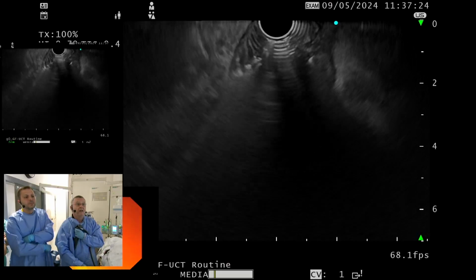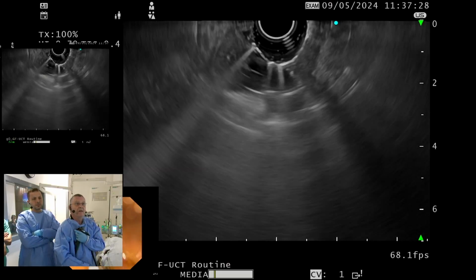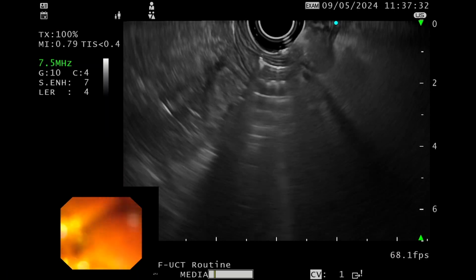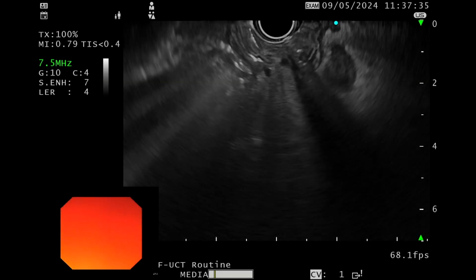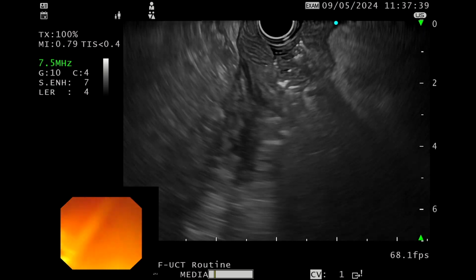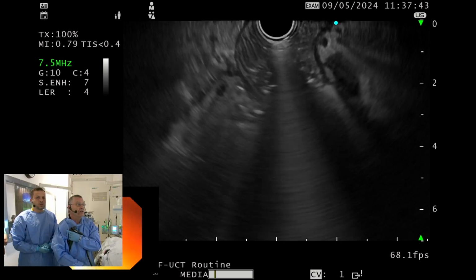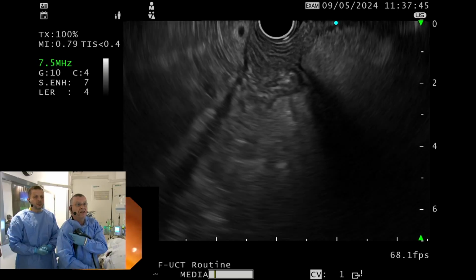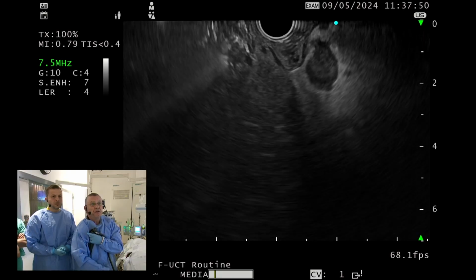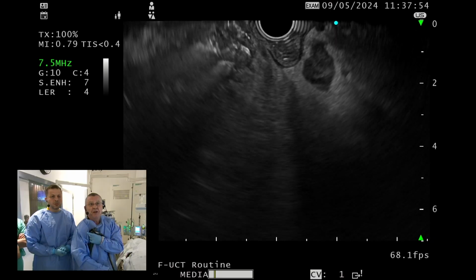Dr. Palazzo, would you be able to assess ductal invasion with a stent inside, or would you prefer to remove the biliary stent first for assessment of ductal invasion? You will see that in that case, of course, when it's small, it's not a good thing to have the stent. Because if you want to stage a small lesion with a previous sphincterotomy, and here you have a large node, which is not beautiful at all.